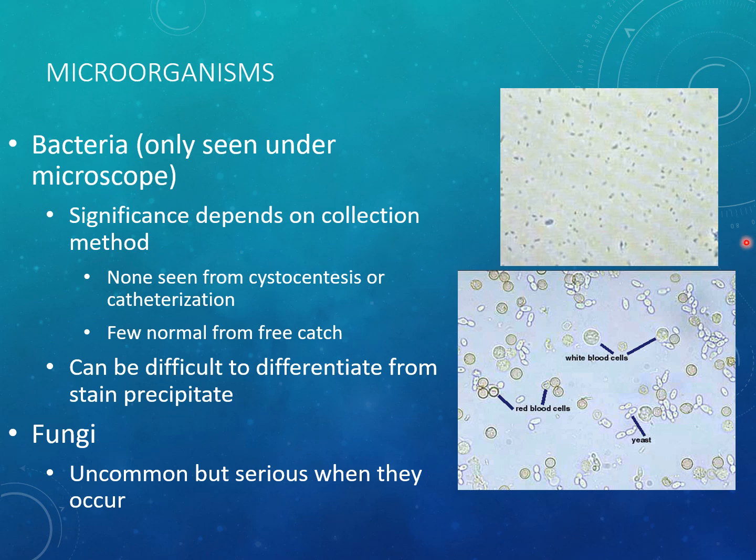And at that point, we would have to run a urine culture, gram stain the slide, and find out what kind of bacteria we're dealing with that caused the UTI. So the culture would be run so that we could get that MIC that we talked about in pharmacology to prescribe the right antibiotic.